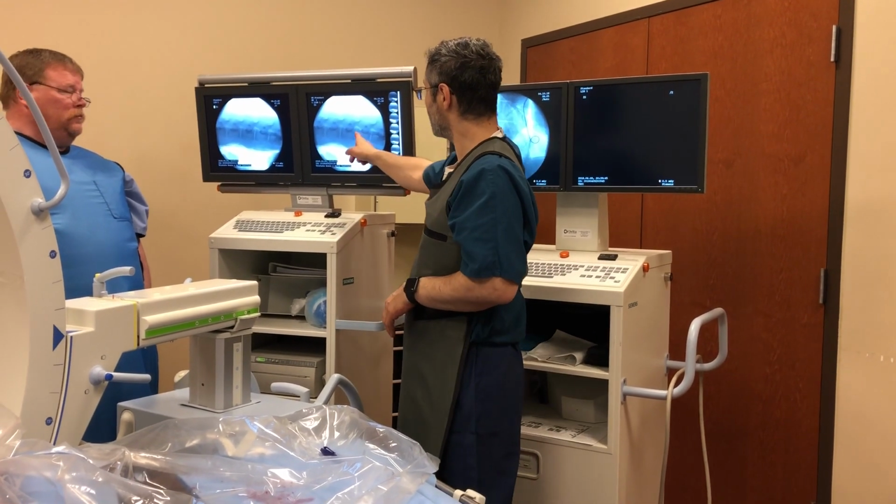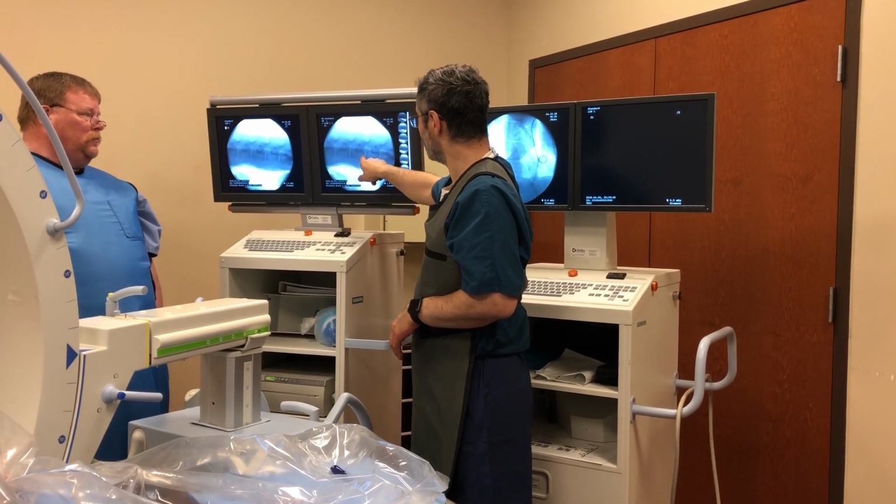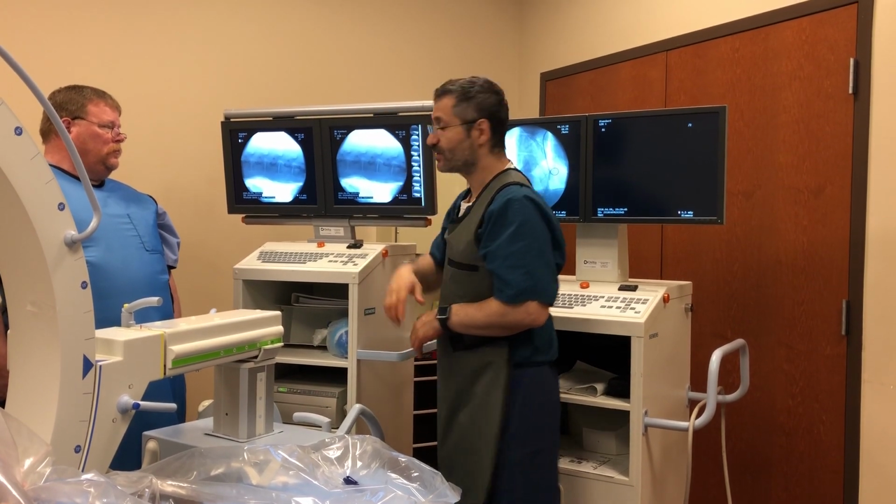You have to, for that level that you are working, for example here, this would be perfect for this level. You see the shadow of the end plates overlapping.